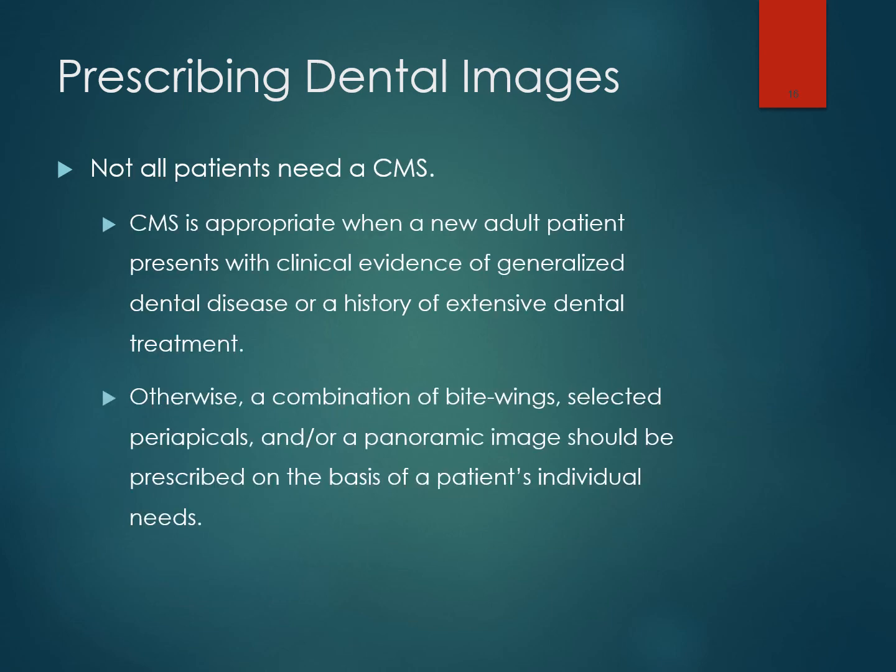On that same note, not all patients need a complete mouth series every time they come into our office. So a complete mouth series, or FMX, is appropriate when a new adult patient presents with clinical evidence of a generalized dental disease or a history of extensive dental treatment. And so we need to take these into account.